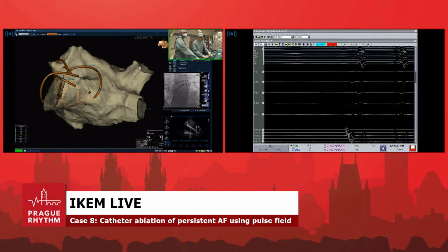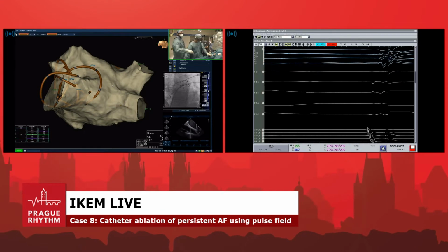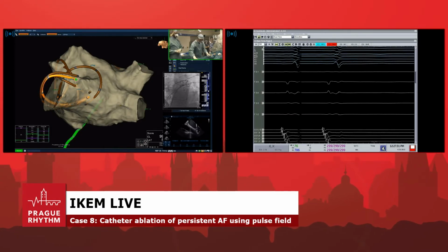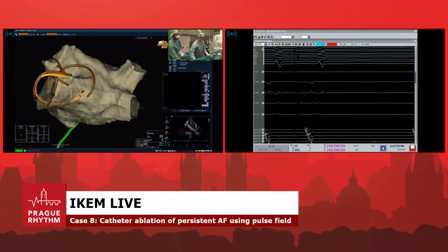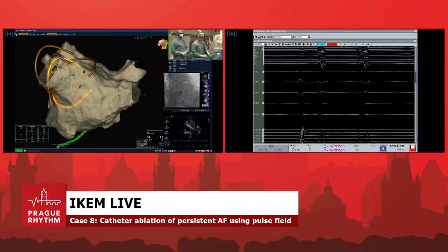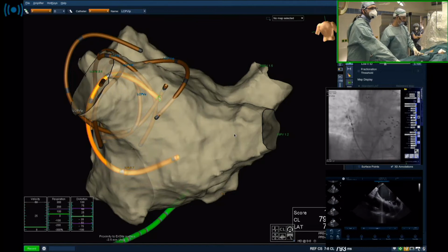Good. Deliver. Okay, we're done with the left side. So what we're going to do now, let's go to AP. Okay, that's fine. I'm going to stay in flower configuration. Retrieve the wire. Let's flex the... Sorry. We have to see the, yeah, this is it.